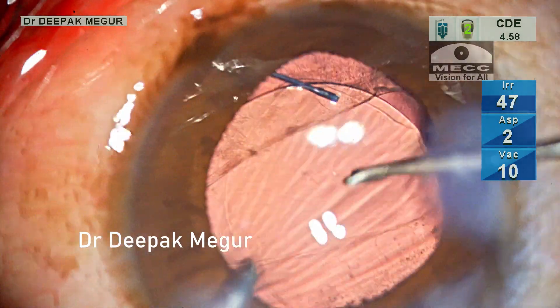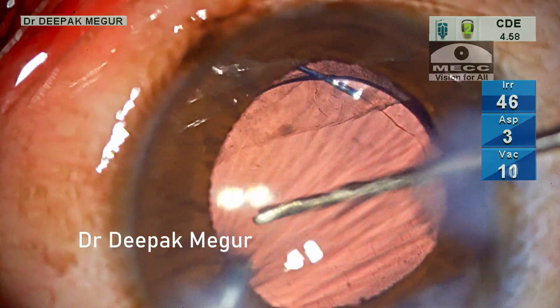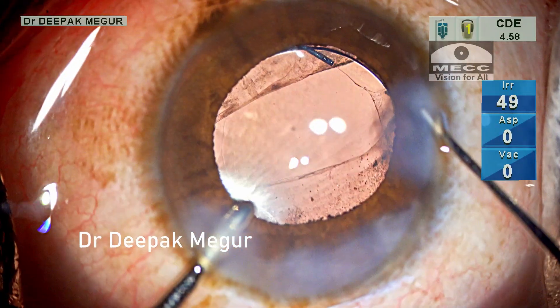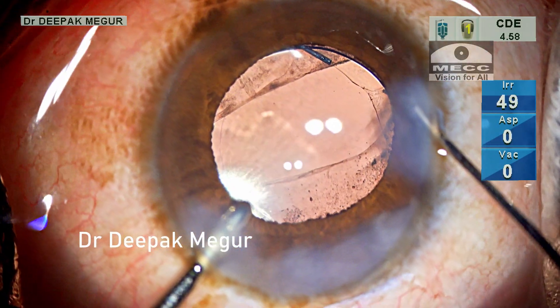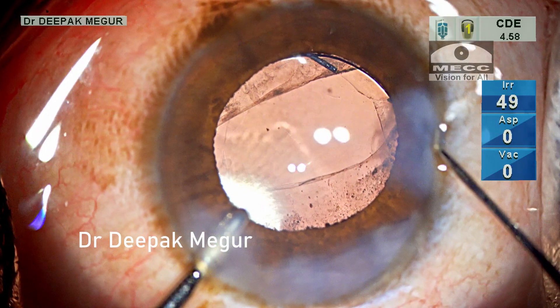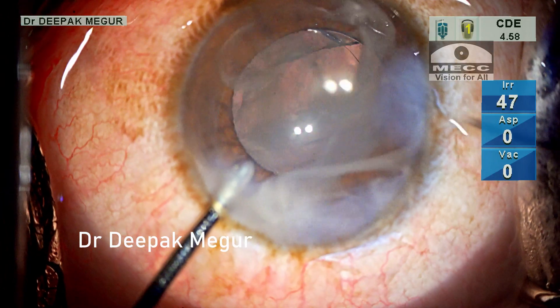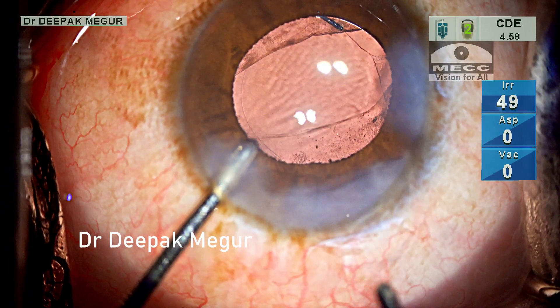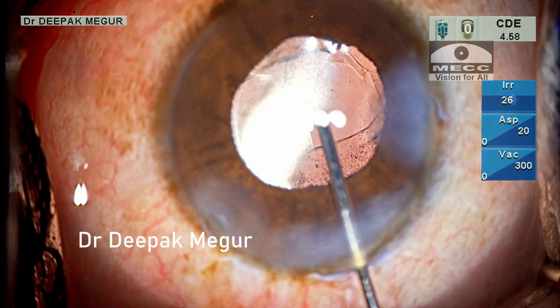Since the optic of the lens is behind the anterior capsule, we don't have to change the refractive power of the lens — I usually use the same lens power which was scheduled for in-the-bag placement. Before closing, one final check with Triamcinolone Acetonide is performed to confirm the absence of any prolapsed vitreous.